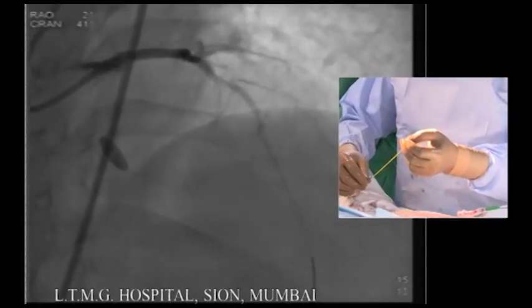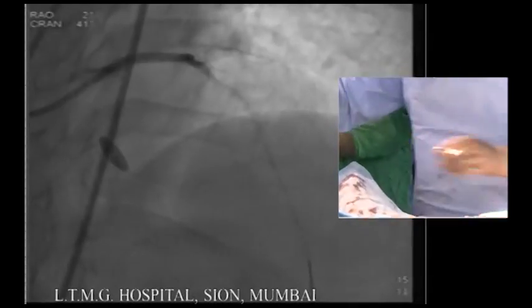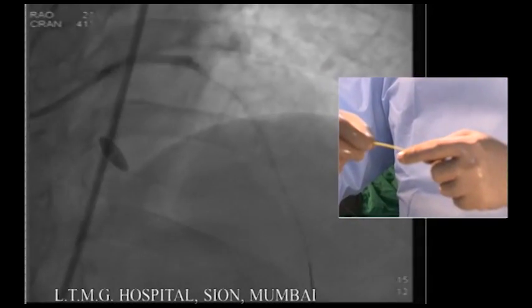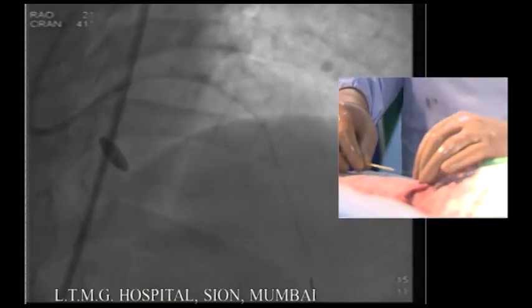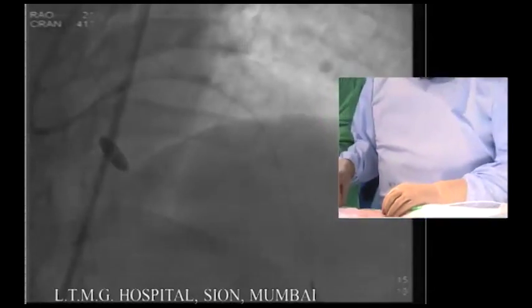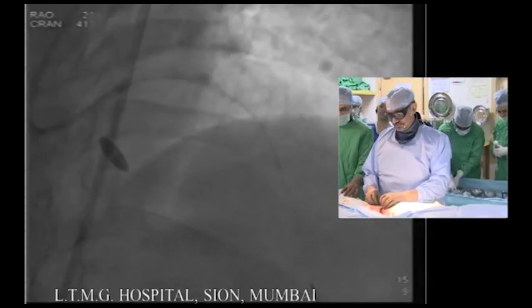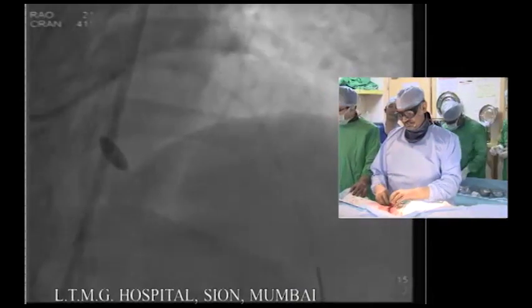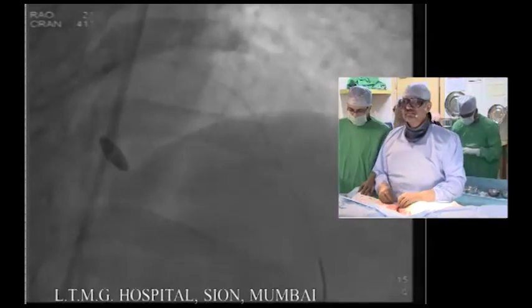So in the audience, how many people use a guide liner in their practice? Okay. So, I mean, guide liner is also not a panacea. You could have a guide liner back-end interaction with your device. So how many people have guideliners in your place? I think the question is how many people use a guideliner in this case, and how many people use a buddy wire.